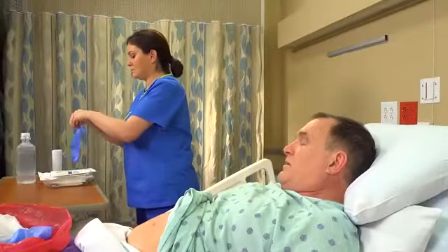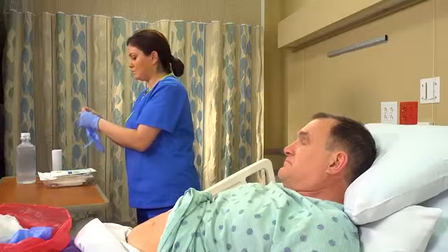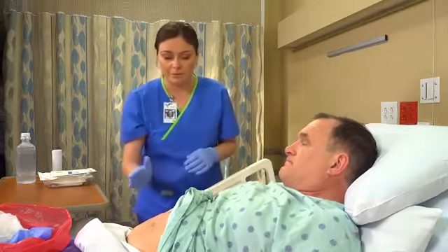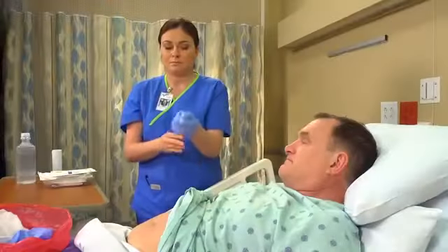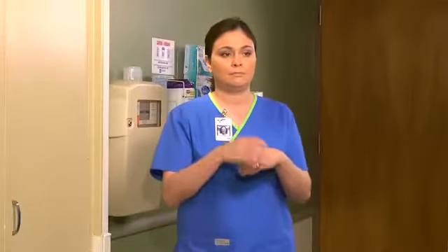Apply another pair of clean gloves and assess the wound. Now I'm just going to assess your wound. Refer to the video skill 'Assessing Wounds' for details. Then dispose of your gloves in the waterproof biohazard bag and perform hand hygiene.